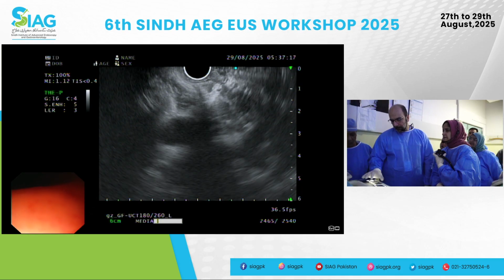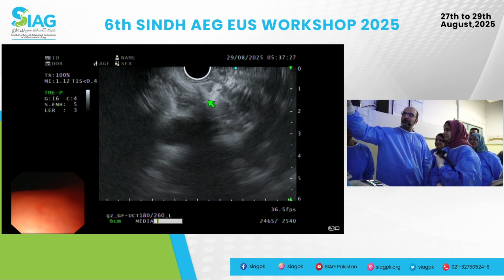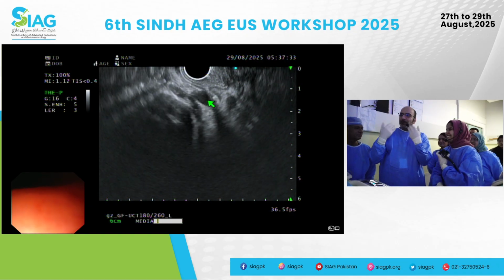Let's see here. Pointer. What is this? Is it a pancreatic stent? Okay, so what is this likely to be? PD. Okay. Yeah. What do you think is between the probe and the portal vein? CBD. Yes. Yes.